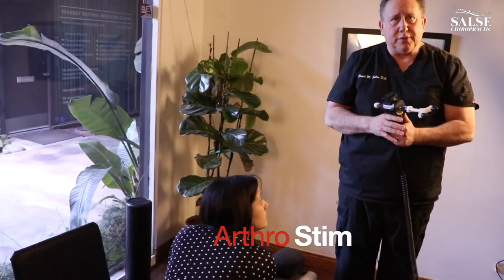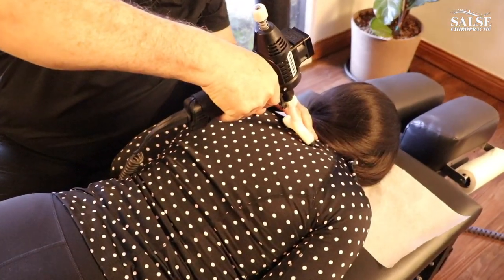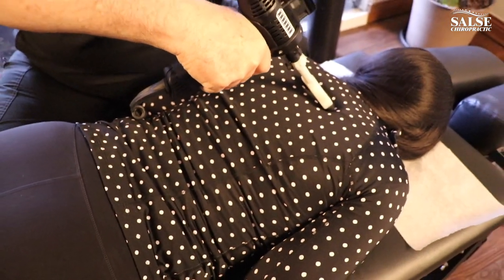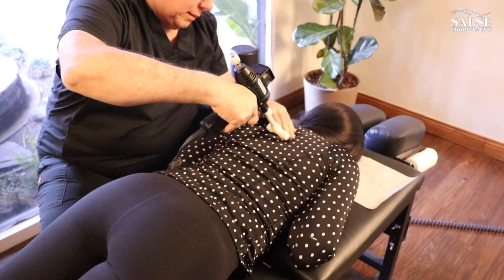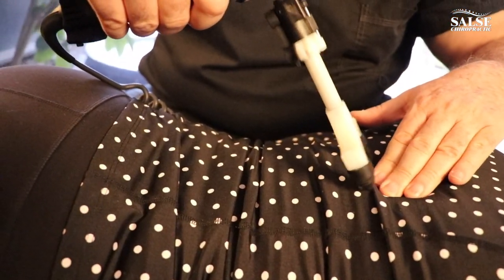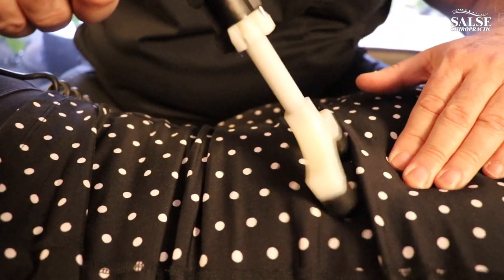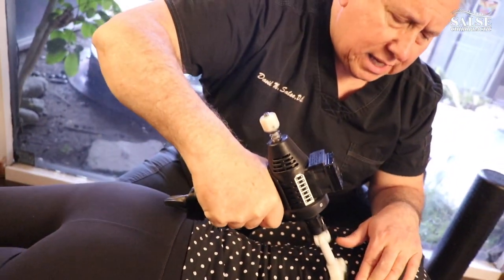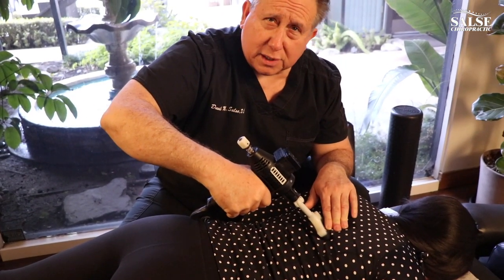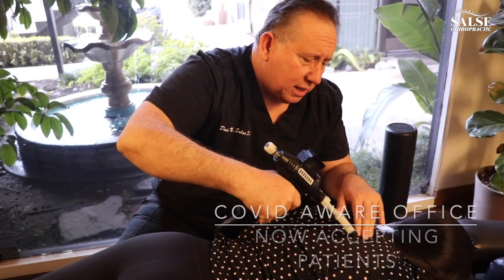To release the spine we'll use the Arthrostim, and this is great to take the tension off of her spine. Now the benefit of the Arthrostim is as we work with Rachel on this, I can already feel the muscles starting to relax, but it also helps to release the tension around the spine so when we do the adjustments it feels nice and smooth. With some patients this is all we need to use if they're too acute.